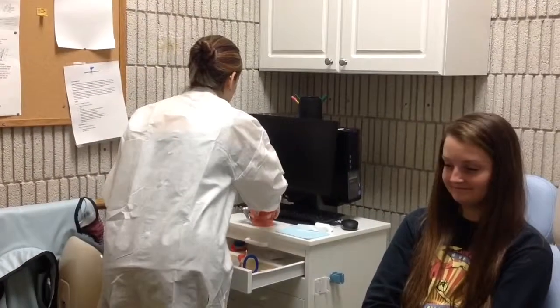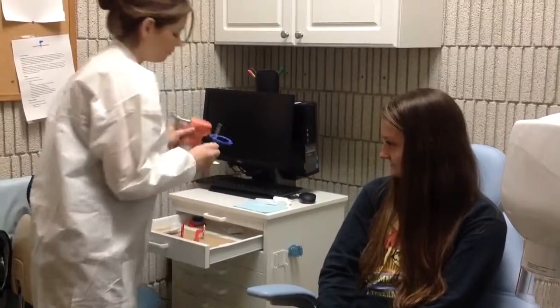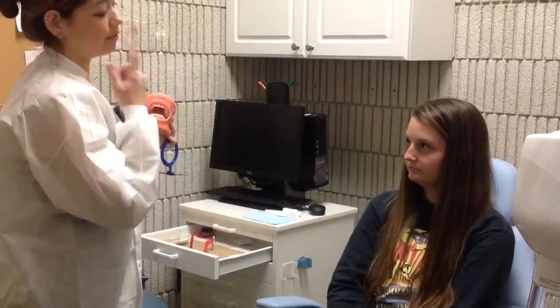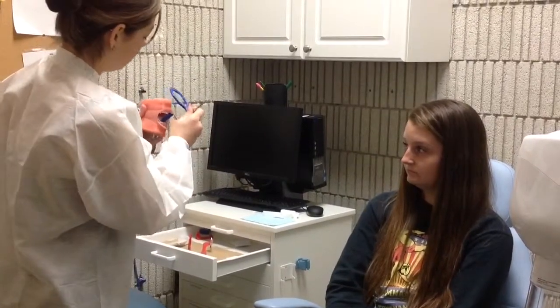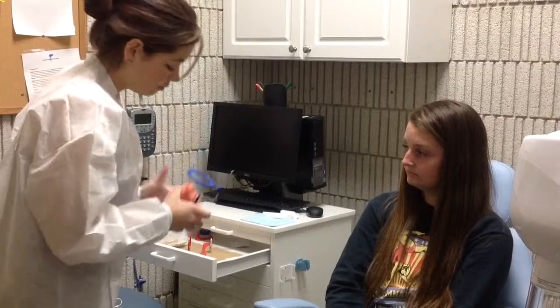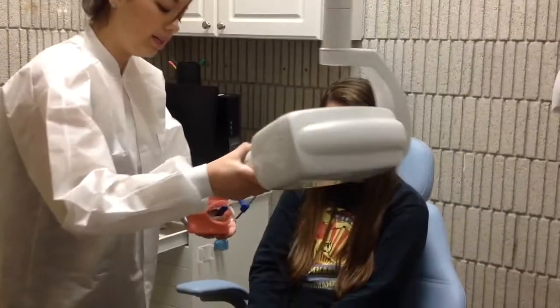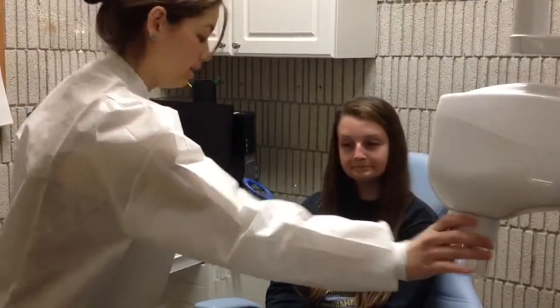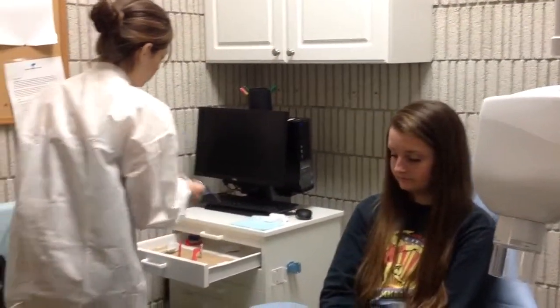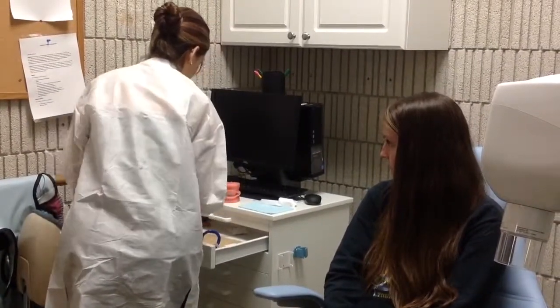Okay. Since you don't remember, I am going to show you. I do have a little mouth over here. So the first picture that we're going to take of your front teeth, to make sure that they're not broken under your gums, you're just going to bite down right on this little blue piece. And this is my camera, and the camera's going to point right at your nose. Okay. So that's how we do the first one. And again, I'll show you a little bit more before we actually do it.